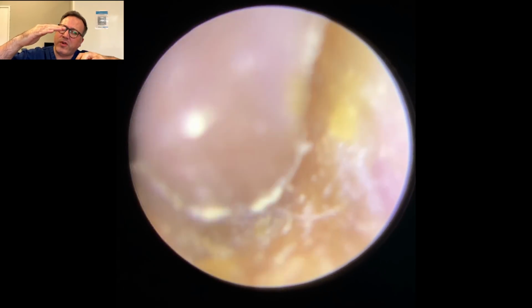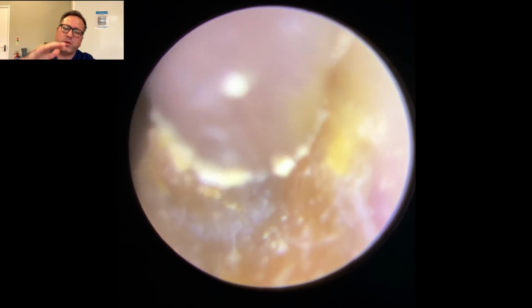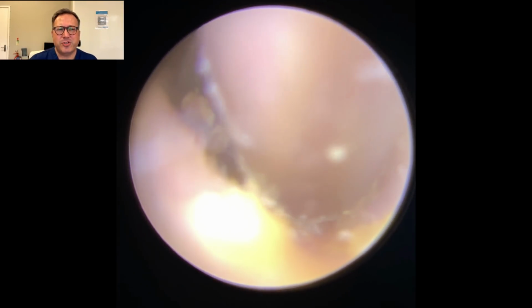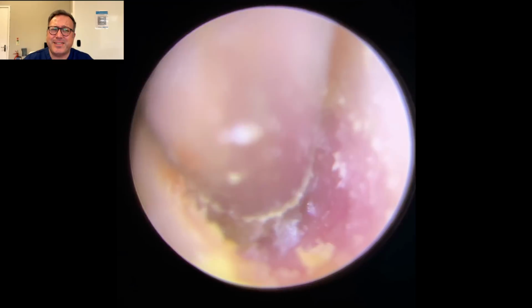So if you can get a good grip on this wax, which is what I'm trying to do at the base section, then as you lift, if you imagine, you're going to peel much further along the canal. There we are. You can just see it starting to come away now. It's just loosening up. You can see that dry flakiness to the skin underneath there.